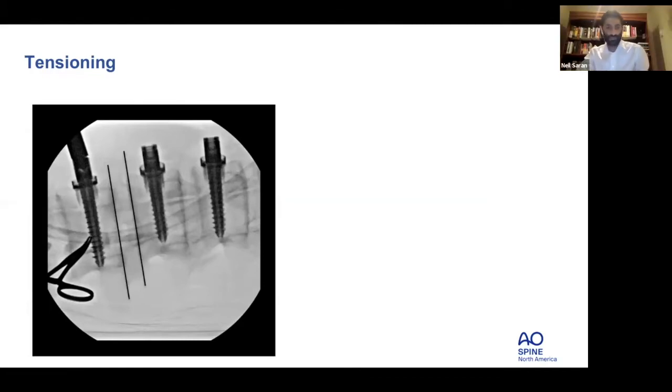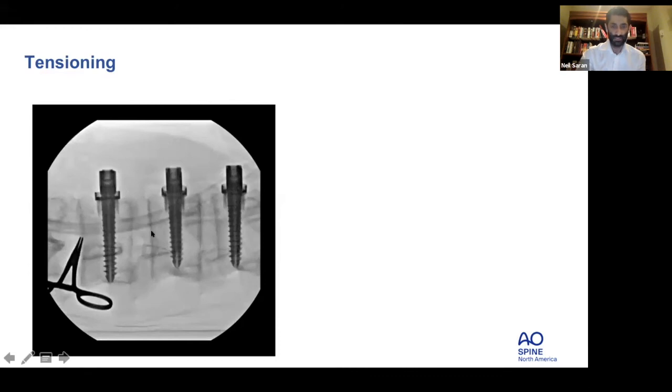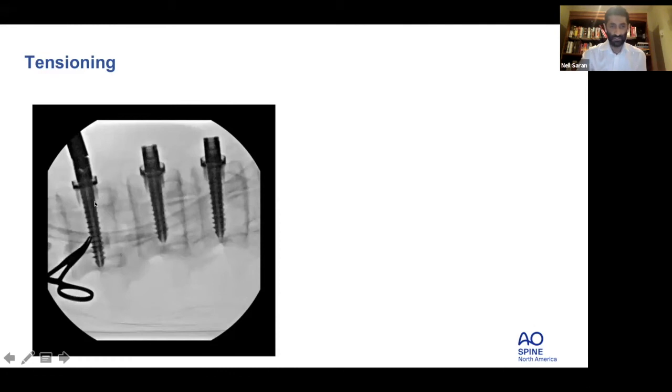Yeah, that's right. So I'm doing kind of both. I'm doing it segmentally, and then I do it as a whole at the end to double check where I'm at. So I really have an idea in my mind that, okay, most of these discs, I want them parallel when I'm done. And so that's what I'm aiming for. So I'm loading each level as I tension. I click my tensioner, and then I load it, and I see, where does the disc end up? Does it open? Here you can see prior to loading, it looks like it's over tensioned here. So I'm going to test and see where it goes. Okay, so I've cranked it out, and it's just getting to parallel. It's not over tensioned.